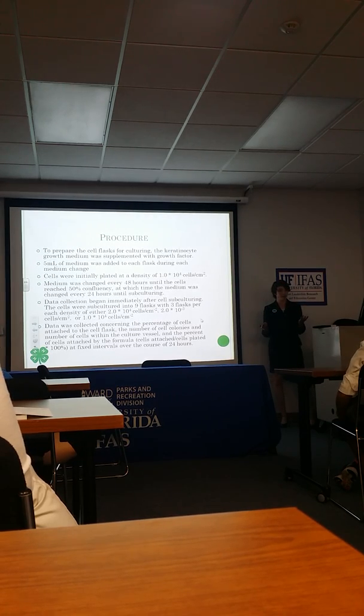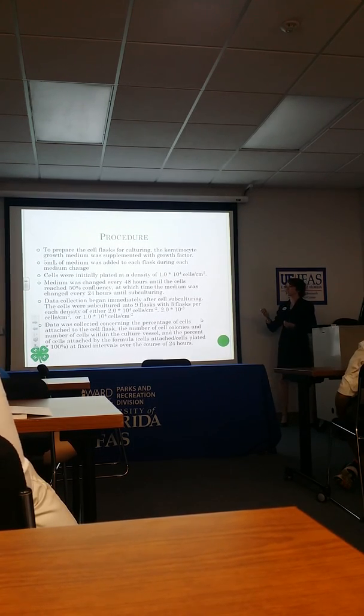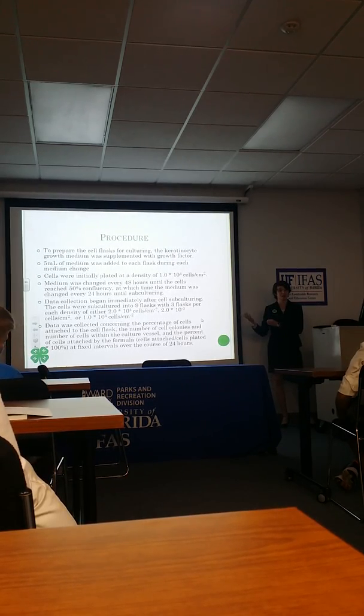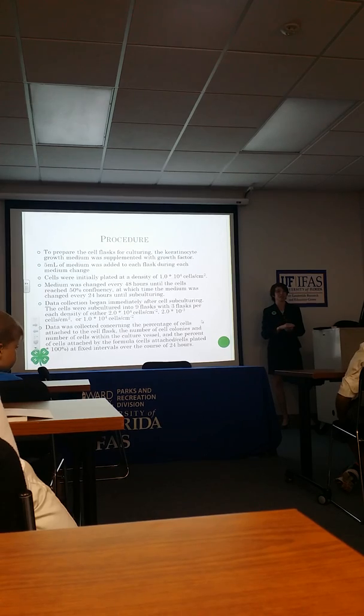Subculturing and culturing, by the way, what I was doing in my initial experiment was simply taking the cells that were cryopreserved in vials that I ordered from an online science company, and I plated them by inserting them into this flask.